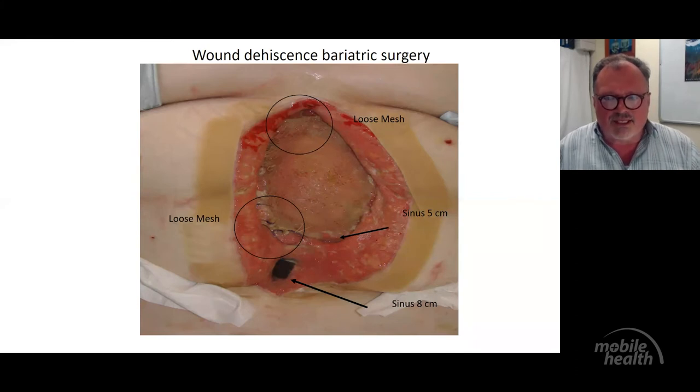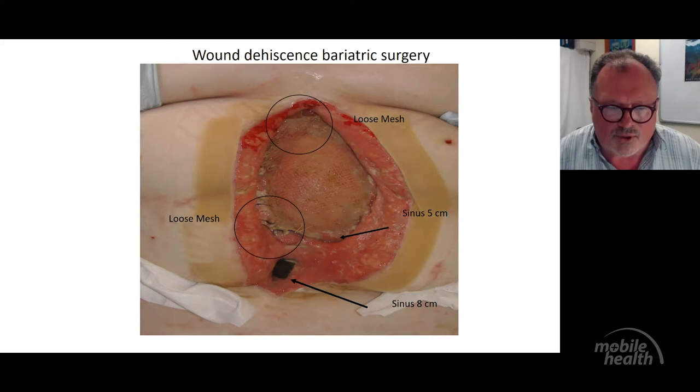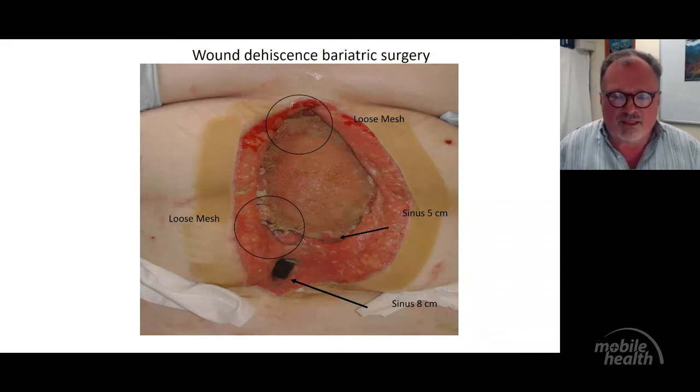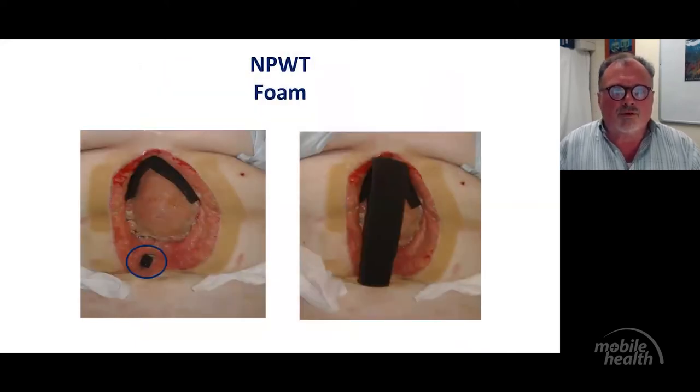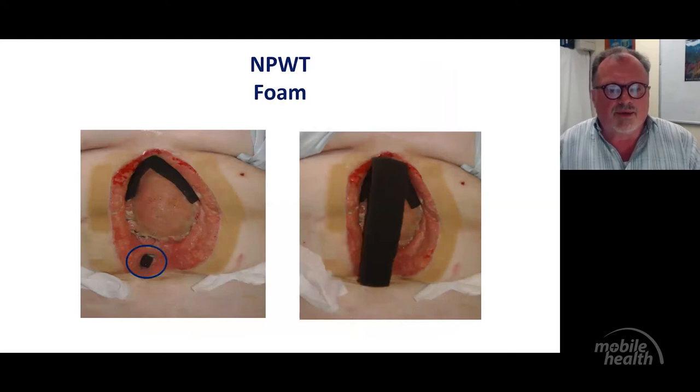So you can see already a foam in place, which is, I don't know why they make this foam black. If anybody out there in the country can tell me why they make this foam black and not a different color so you can see it better in the wound, it would be useful. So please let me know. So this is a large abdominal wound. The foam itself is applied here in the sinuses and then in the undermined areas, so you've got pieces. So you count the pieces, 1, 2, 3. Then you put a piece in the middle.